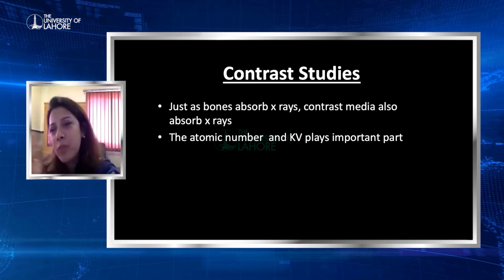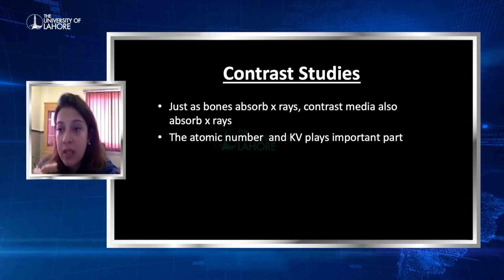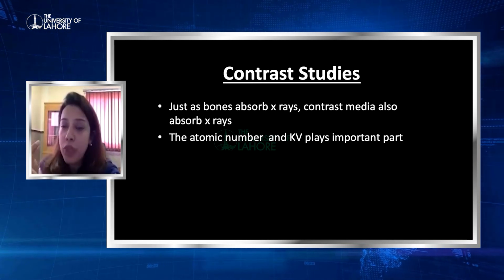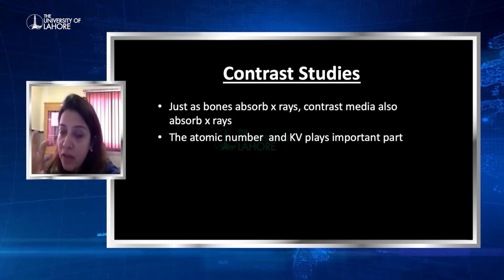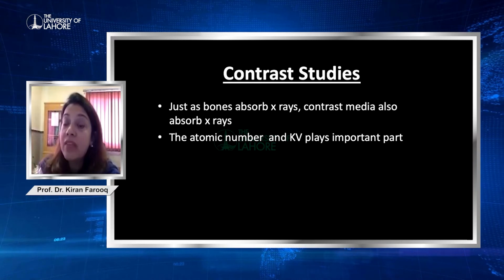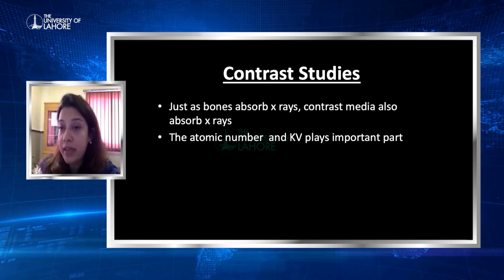So the difference between the X-ray and this study is that you are doing real-time imaging. You're asking the patient to drink a contrast, usually barium, and then you are taking serial images. So you are looking at it in real time. You can see the peristalsis. You can see if there is something wrong with the peristalsis, if there is some filling defect, etc.